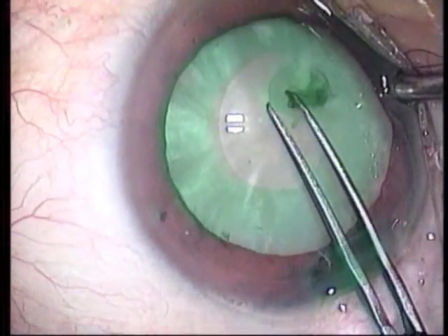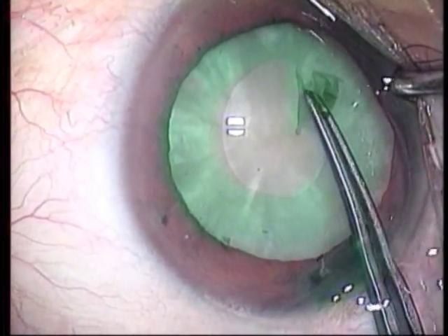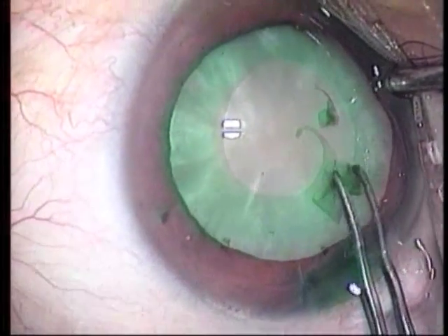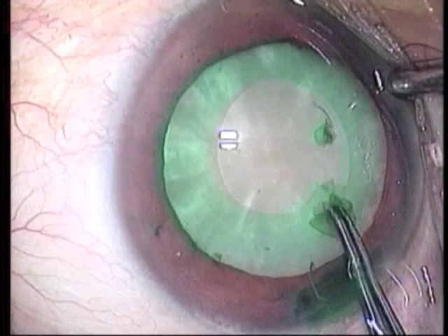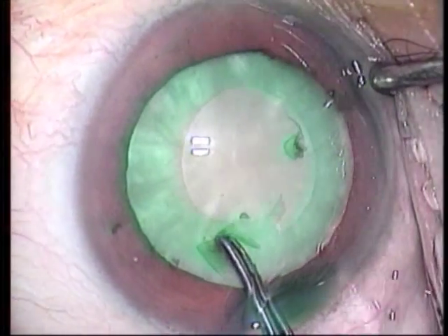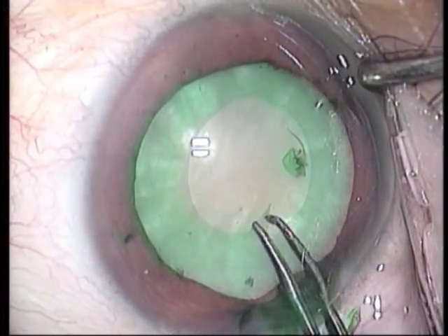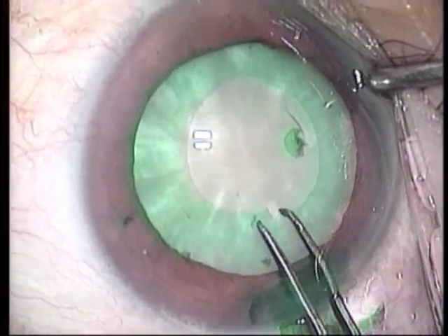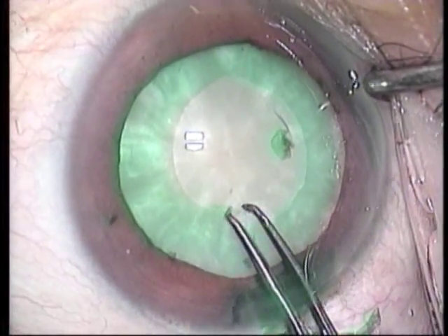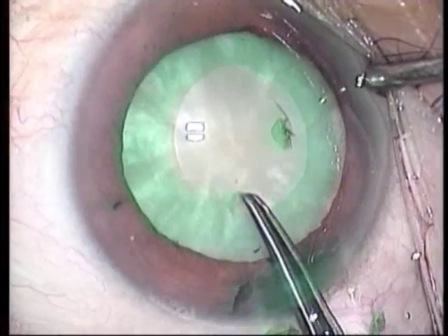The capsule is too fragile to continue the CCC and breaks up into small clusters. The capsule is gently grasped and peeled repeatedly with the forceps. Then, something unexpected occurs.